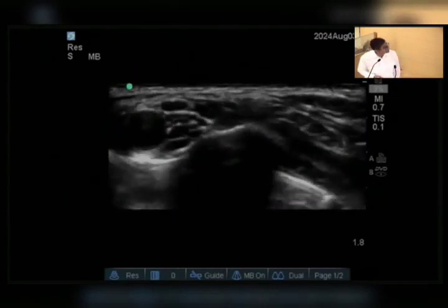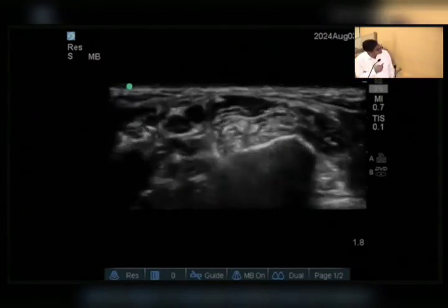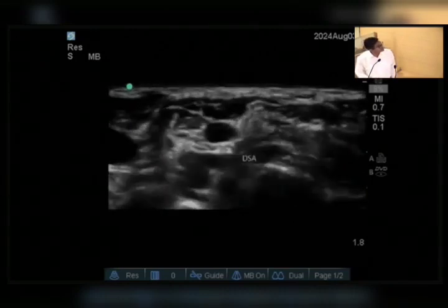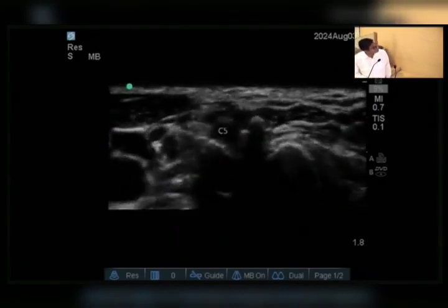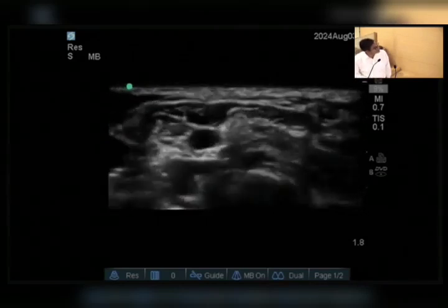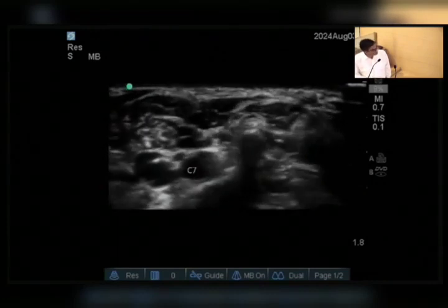Again, the second technique is traceback, in which first we go to the supraclavicular region and then reach the interscalene. See, this is C7, dorsal scapular artery, C6, split C6, and C5. Again, we go caudally: C5, C6, dorsal scapular artery, and C7. So this is the method by which we can scan the interscalene approach.